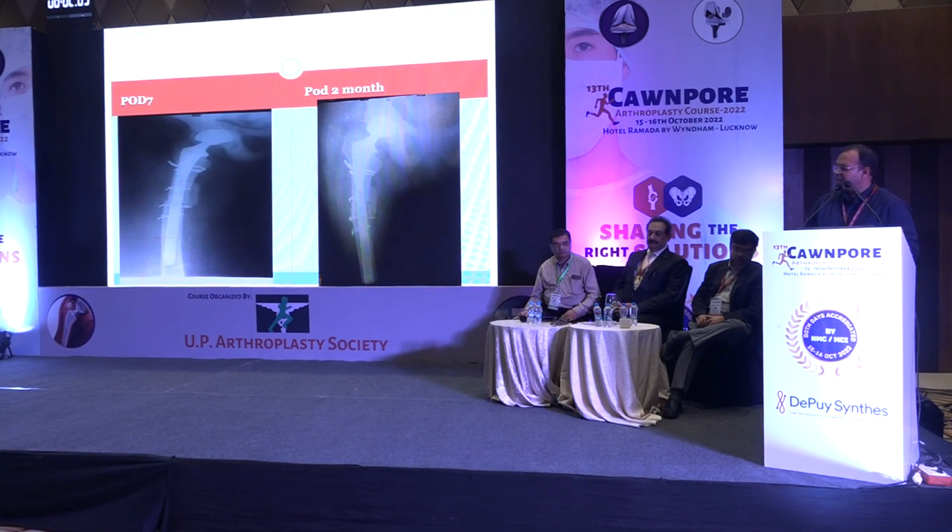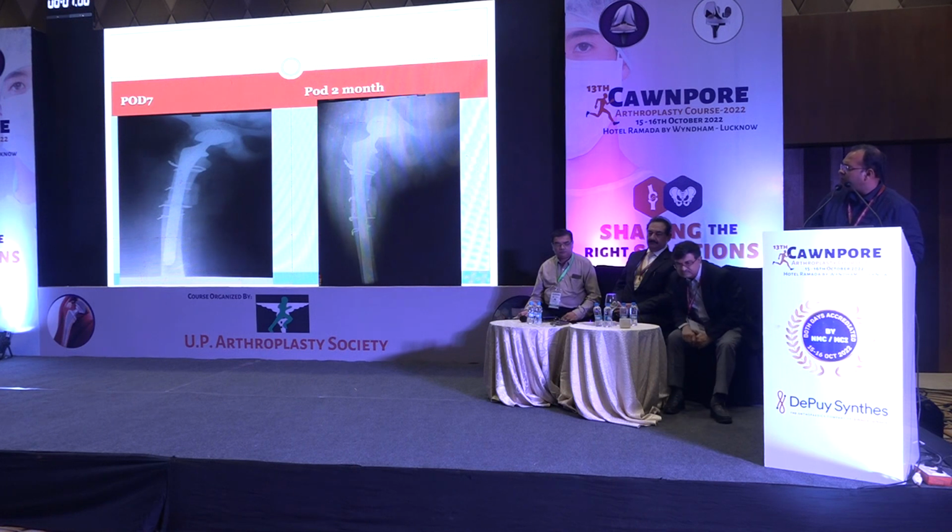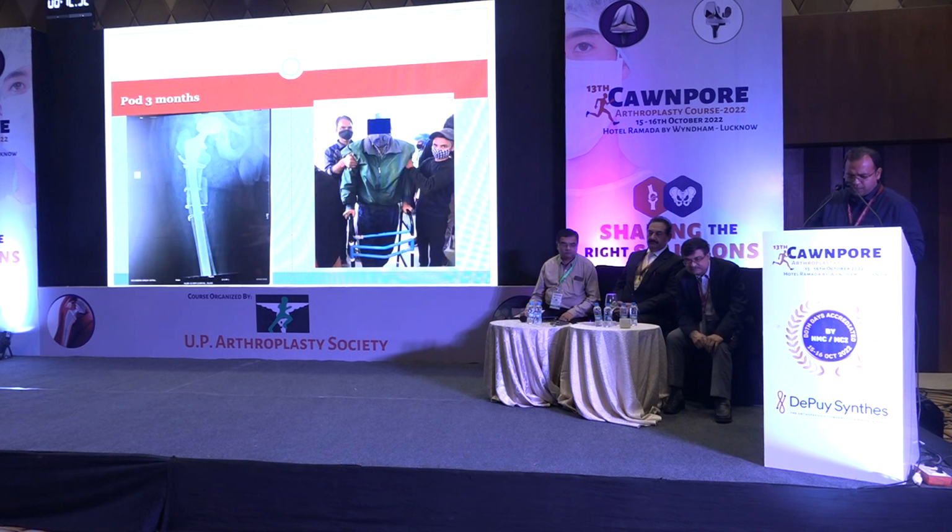This is post-op day 7. This is the long fracture fragment. This is the medial one. You can see the separate fragment which was there. And this is post-op at 2 months. So this is at 3 months. The osteotomy is holding well. The fractures are uniting. The person is able to walk.